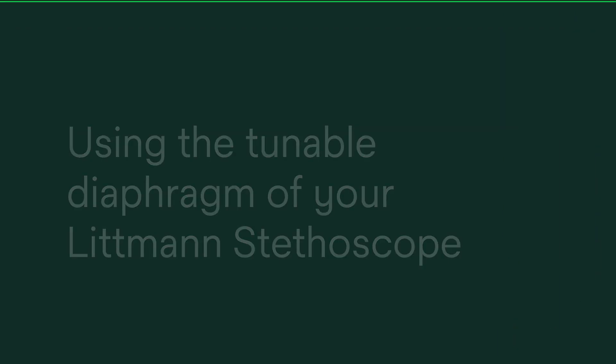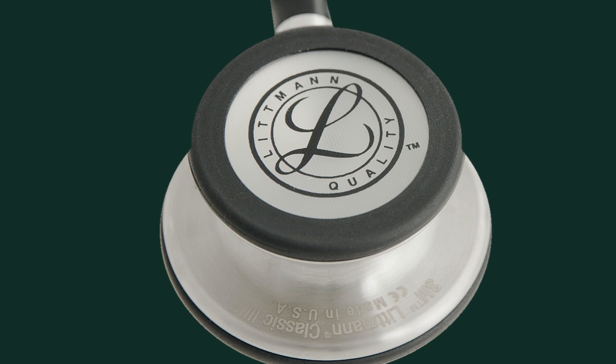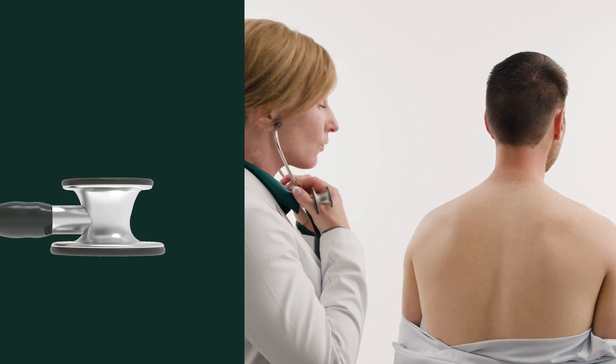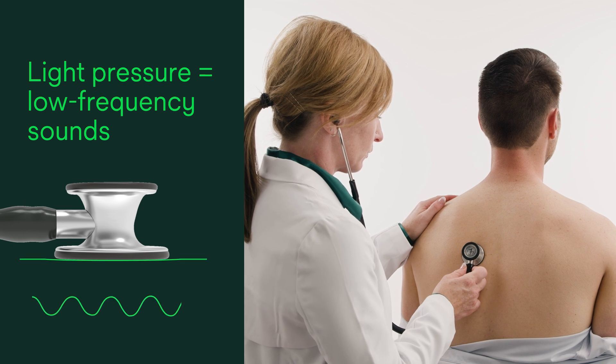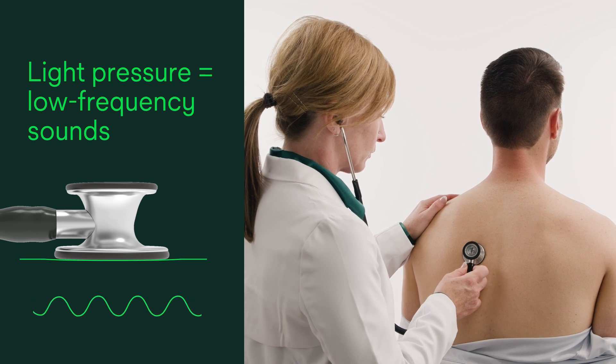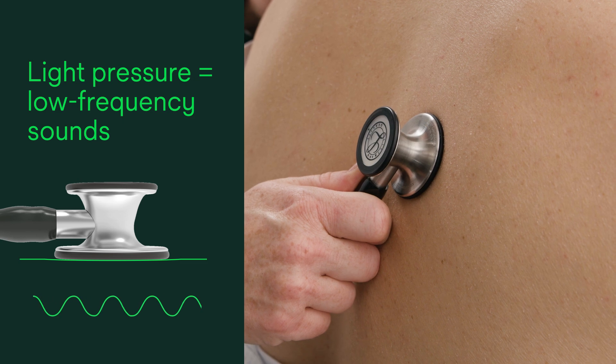The tunable diaphragm technology inside your Lippmann stethoscope allows you to hear different sounds without repositioning. With light pressure, you can hear low frequency sounds. Rest the chest piece lightly on the patient. In this position, the diaphragm membrane is suspended, allowing it to resonate with low frequency sounds.